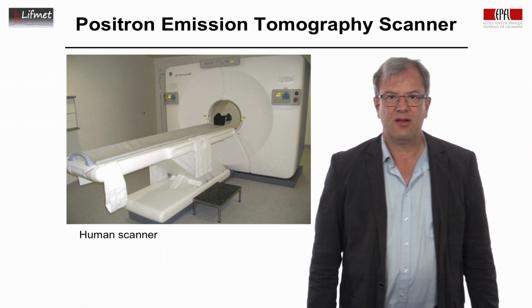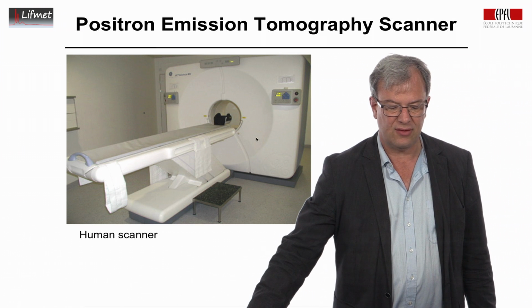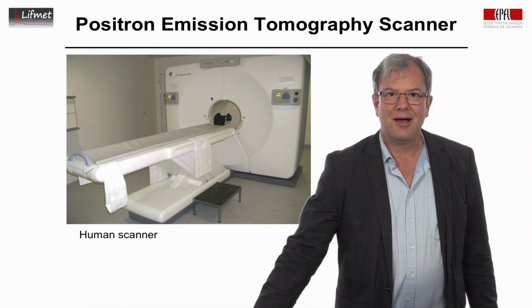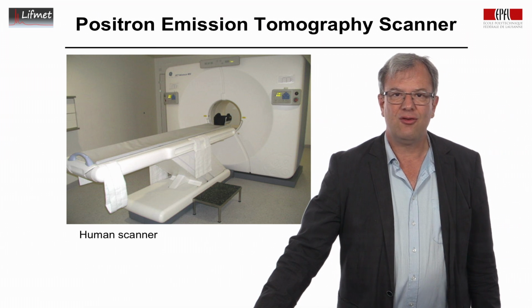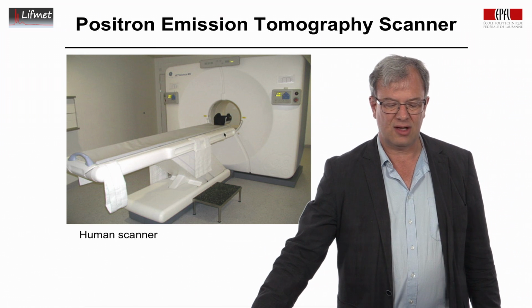So what does a PET scanner look like? A PET scanner is shown here. We have the scanner with a nice white cover. We don't want to expose the patient to all the physics and engineering that's behind it. So there's a nice cover that makes it less intimidating.